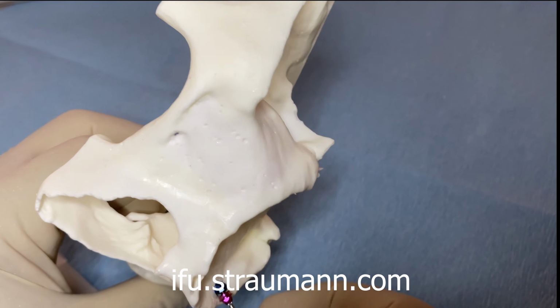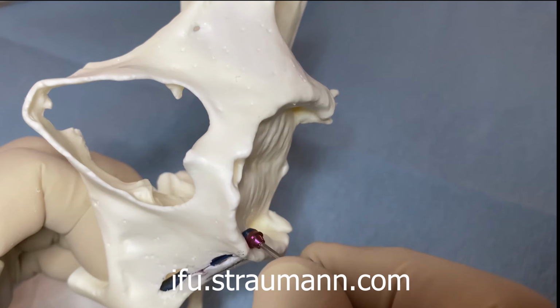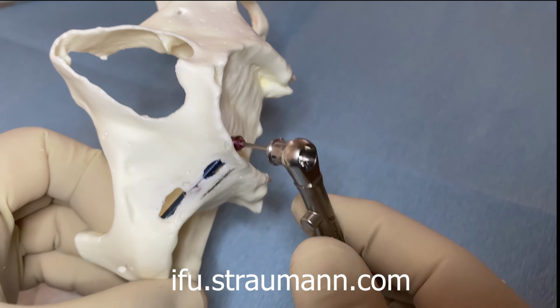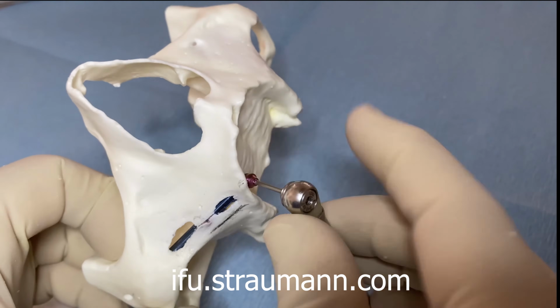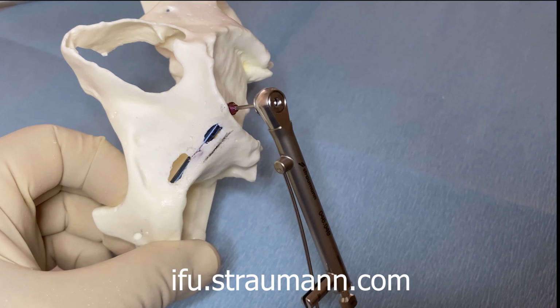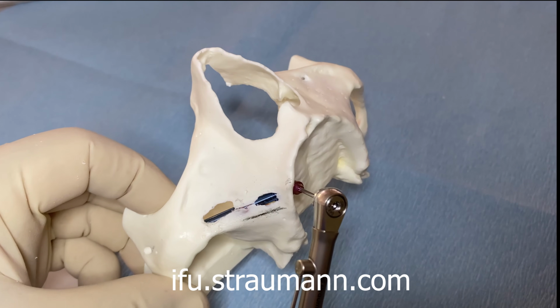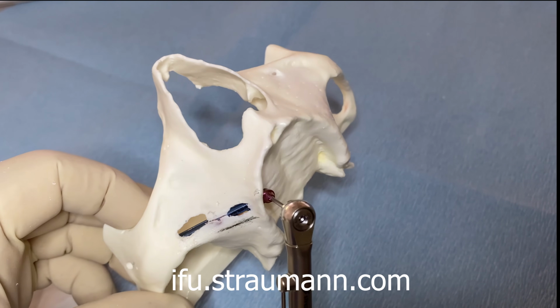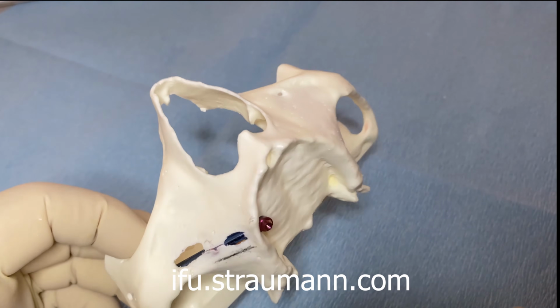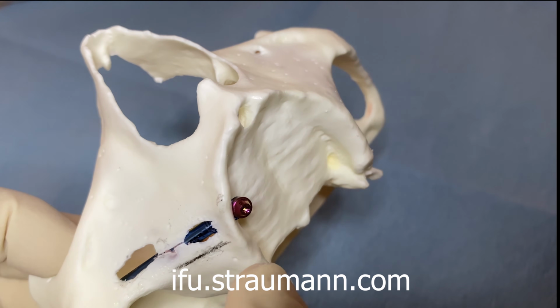Once we get this in the right place with our finger driver, we go ahead and give it a 35 Newton centimeter torque. And what's interesting is this is another confirmation when the implant does not rotate, just like in any other case, it's a confirmation that we have nice initial stability of 35-40 newtons of our zygoma implant. So now we can go ahead and put our temporary titanium cylinders on here and convert the case.